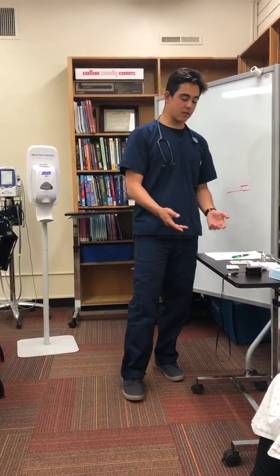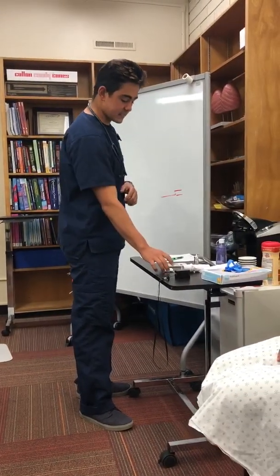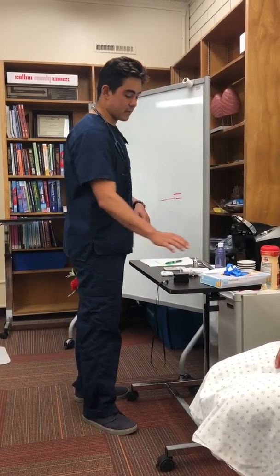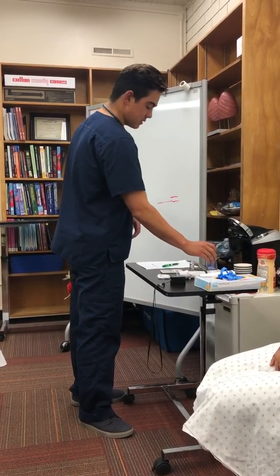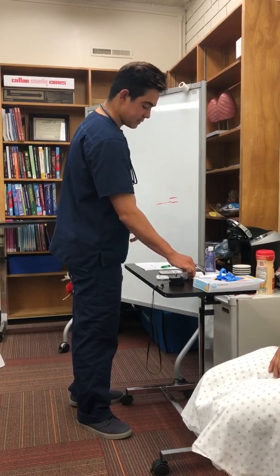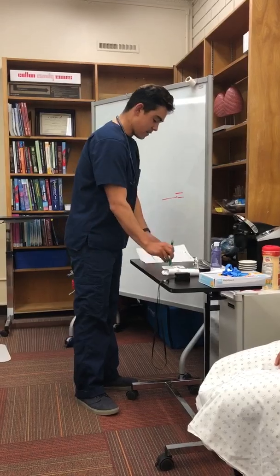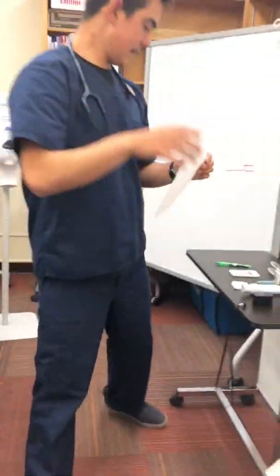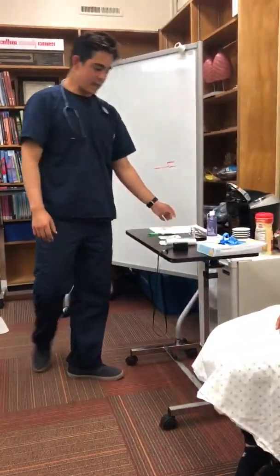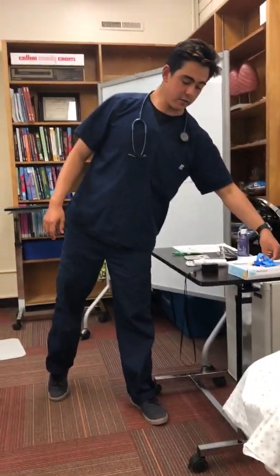After that, we're going to go ahead and gather our supplies. So for this, I want my pulse oximeter, my stethoscope, disinfecting wipes for my stethoscope. I have my gloves and PPE. I have my holding chamber, my spacer. I have my incentive spirometer for the test, my calculator to do the calculations. I have pen and paper, my paper flow sheet to record with nothing on it besides my name as the respiratory therapist, as well as my hand sanitizer. I also have a napkin for the patient to cough into after their treatment.